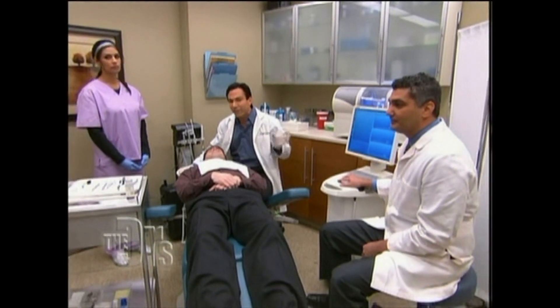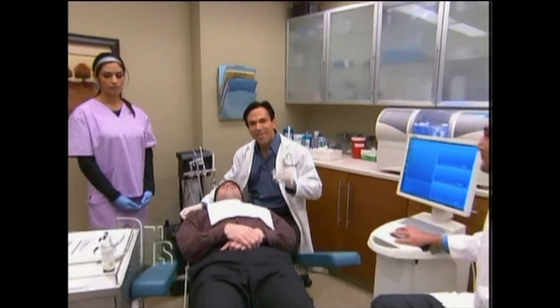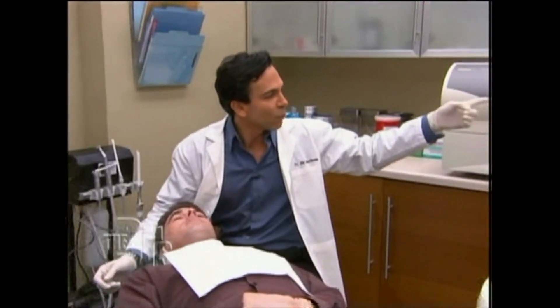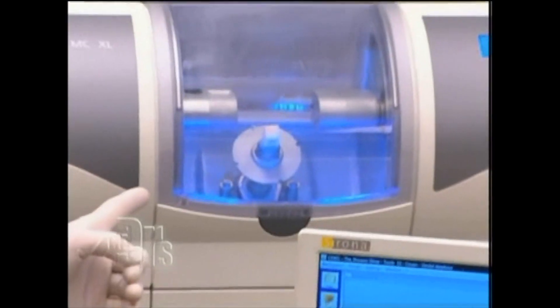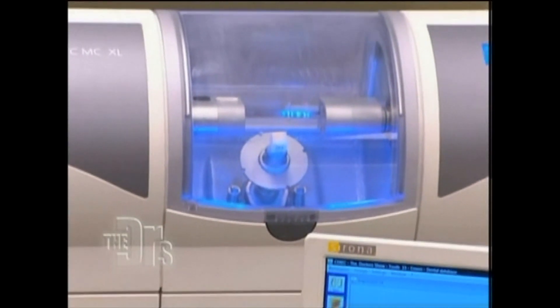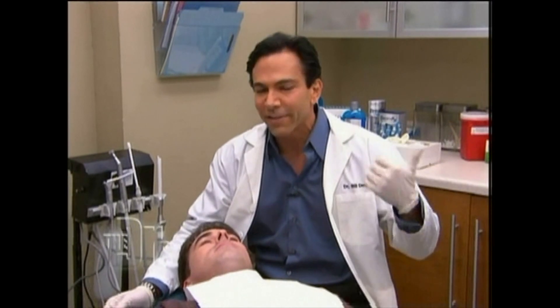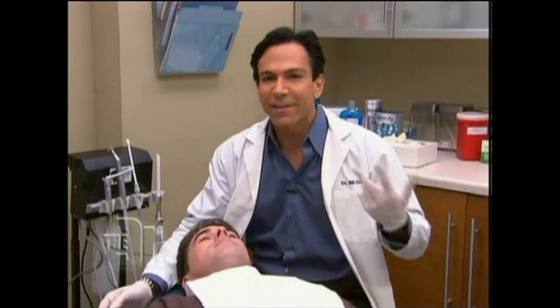We're going to take an impression digitally — I'll show you that in one second. And then, as soon as we get that impression, Travis, I'm going to place it right into this CEREC machine, and we're going to mill a crown instantly for you. We'll cement it right on. The great thing is he doesn't have to leave with a temporary, he doesn't have to come back for a second appointment, he doesn't have to get anesthesia twice. It'll all be done now, today, here.